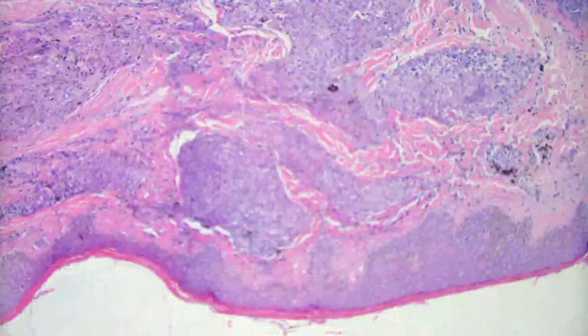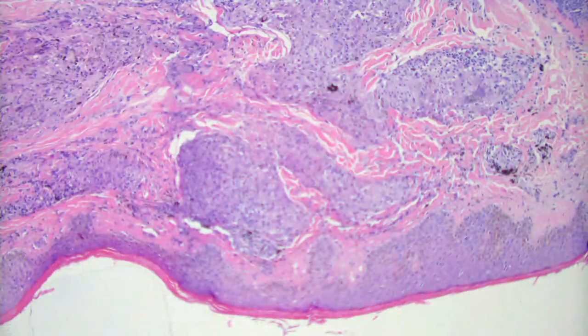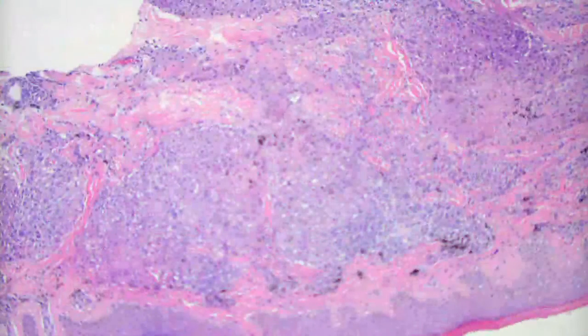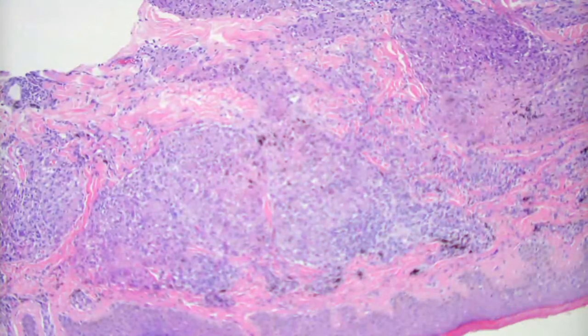So this is a shave biopsy, and on high magnification, you can see almost like granulomatous inflammation. You can see a lot of dark pigment, very foreign material. If you zoom in, I really thought that this was a tattoo, and possibly either a granulomatous reaction to tattoo or another entity that likes tattoo, which is sarcoid. So this could be sarcoid itself that was maybe precipitated by a tattoo, or somebody had sarcoid, got a tattoo, and it localized to the tattoo area.